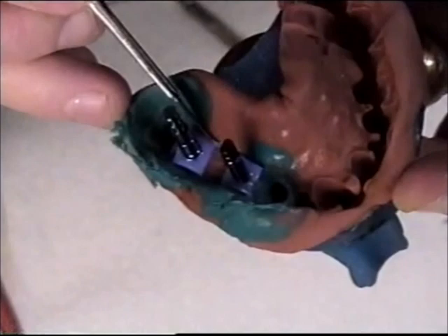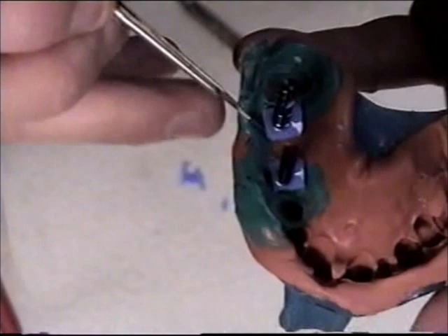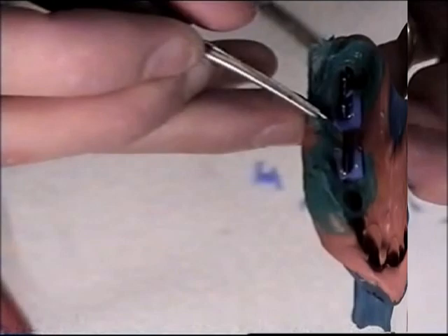Okay, I like to cut the corners off of these as well. A lot of this I'll be explaining after the model is made. But I do cut the corners off. There we go.